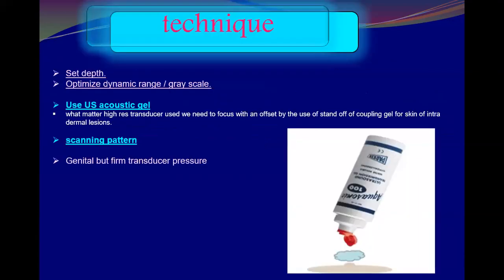After we set the depth and optimize the gray scale, we have to use the acoustic gel. And then we have to select the scanning pattern.